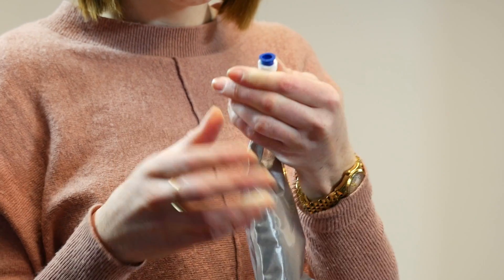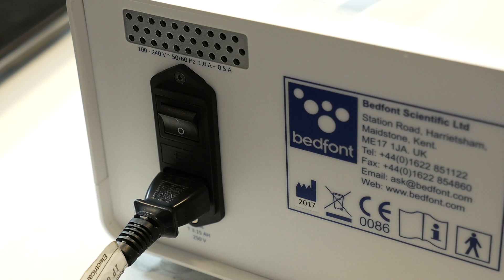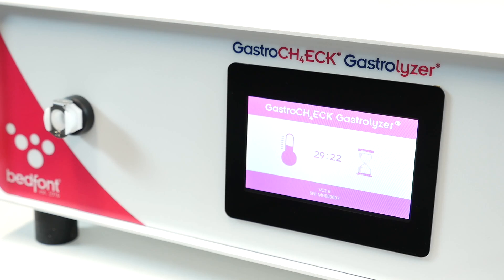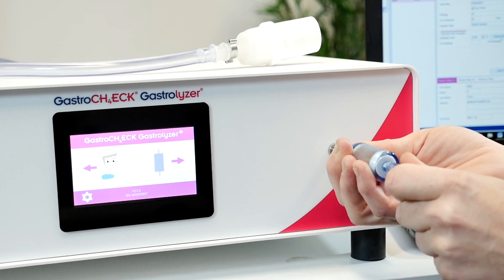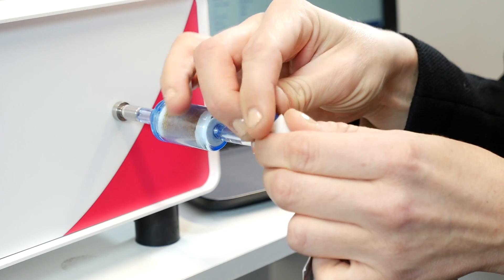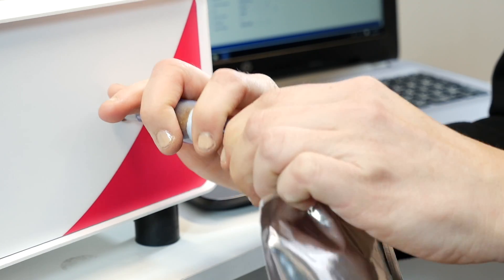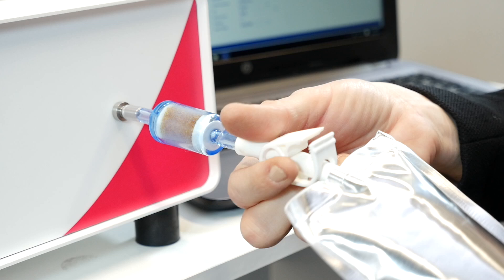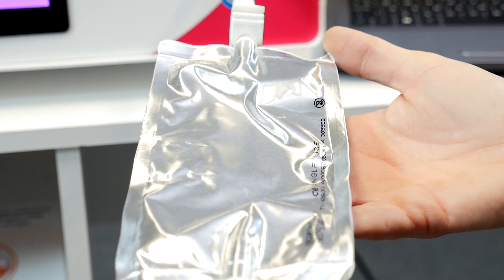Insert the blue plugs to make sure none of the breath sample is lost. Make sure the power cord is connected and the Gastro Check is switched on — the monitor will need about 30 minutes to warm up. Attach the moisture filter to the bag sample connector and press the breath bag icon to begin. Remove the blue plug from one end of the breath bag and attach it to the moisture filter. Open the clamp on the inlet of the breath bag and press the next arrow to begin breath bag sampling.